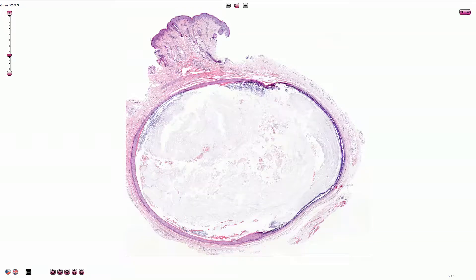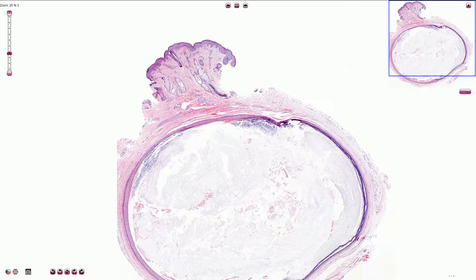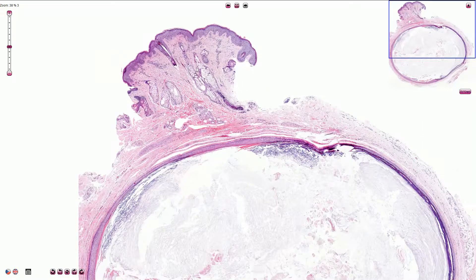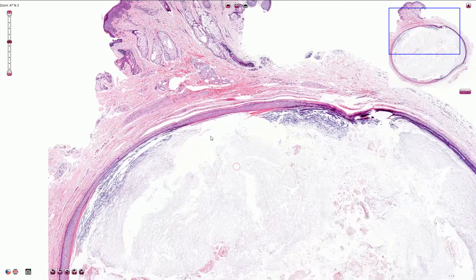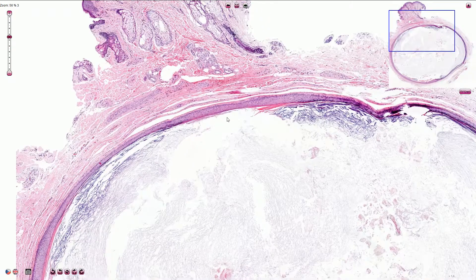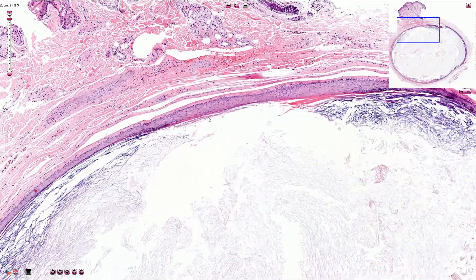Here we are looking at the microscopic slide of the epidermal inclusion cyst. Here we have the skin surface with epidermis, the dermis with hair follicles and sebaceous glands, and here we have relatively large cysts lined by stratified squamous epithelium with normal keratinization.